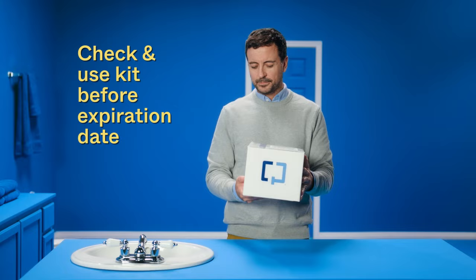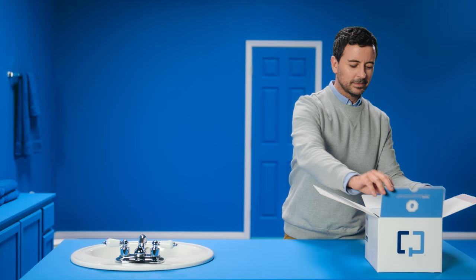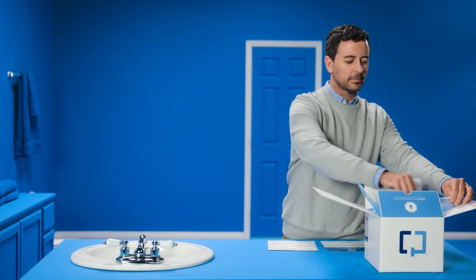Step 1: Check the expiration date on the box. If you're good, then unpack it. First, pull out your patient instruction guides and shipping instructions. Then unzip the plastic bag to take out the contents for collection. Leave the bag attached to the box — you'll need it to safely ship your sample back.